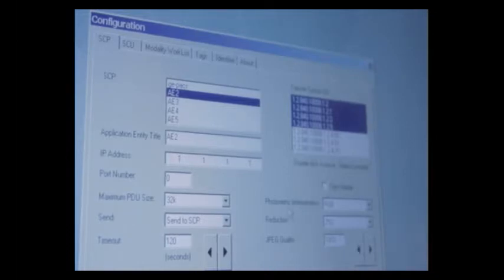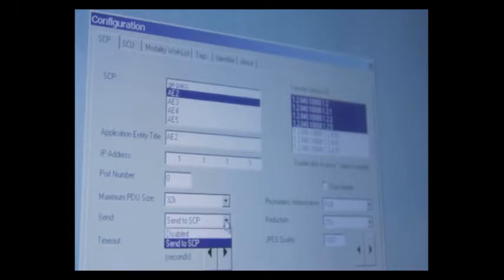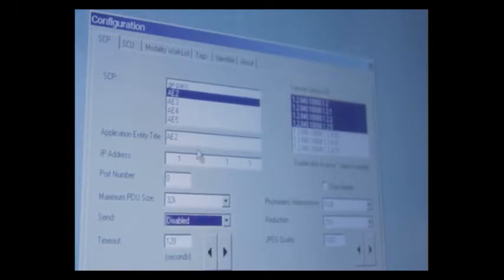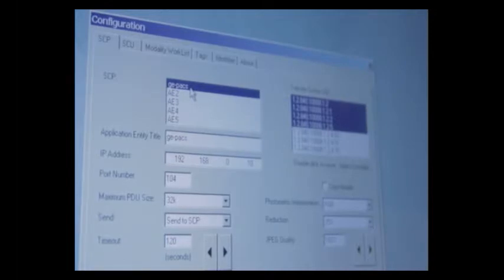Photometric interpretation should be RGB. The reduction should be 25%, and JPEG quality should be 100%. I'm going to disable this setting right here. Please note that your AE title information is case sensitive. So make sure you pay close attention to upper or lower case information.